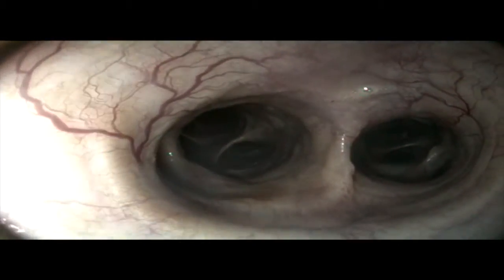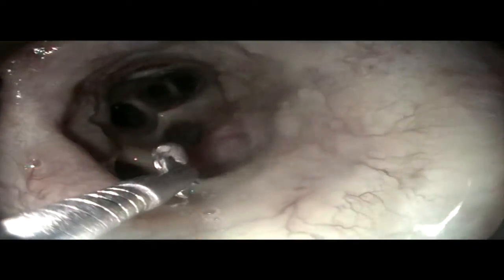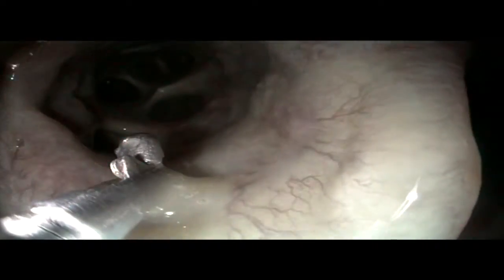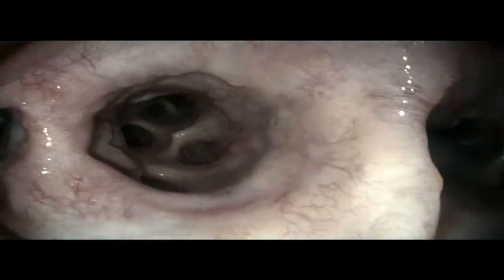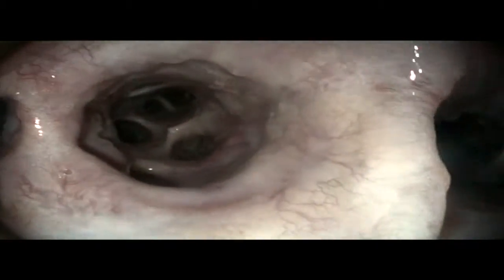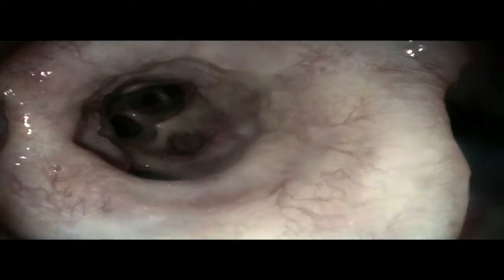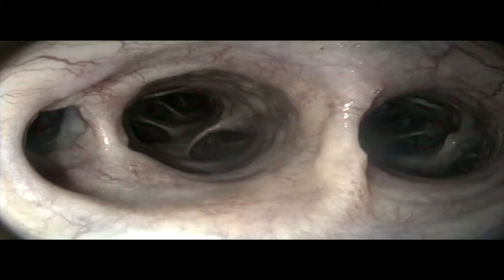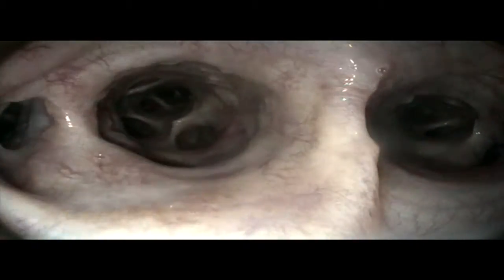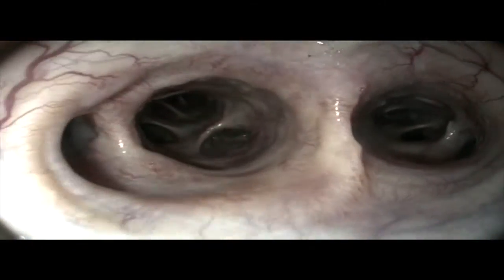Let me show you a clinical case with tracheal bronchitis in a dog. I'd like to tell you that almost all tracheal diseases are visible at the surface of the mucous membranes. It is of particular interest to visualize this structure. Endoscopic examinations of the trachea are an essential field in veterinary medicine. Tracheitis is an inflammation or infection of the trachea or windpipe.